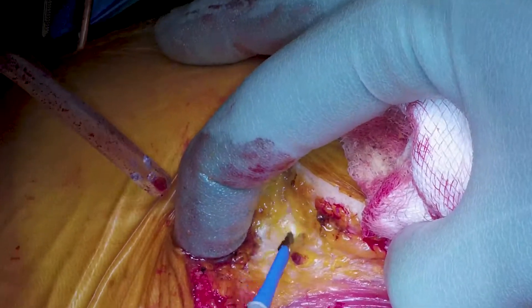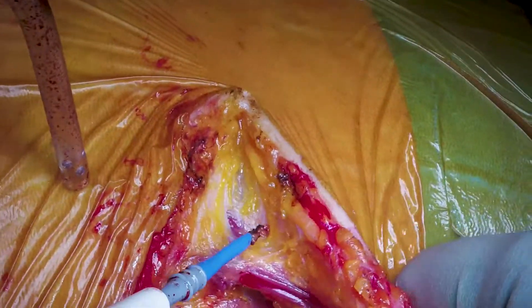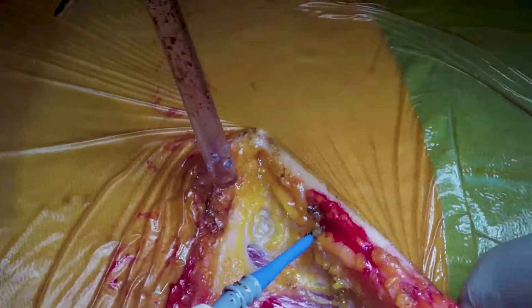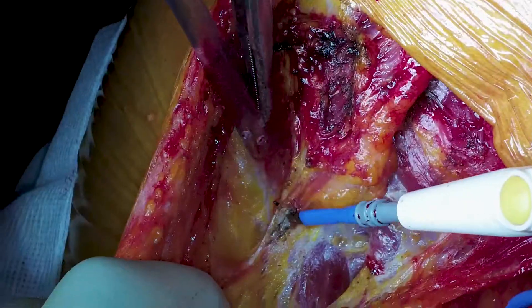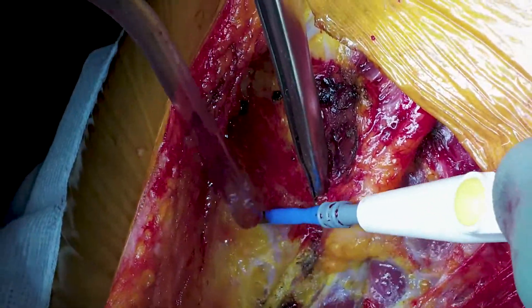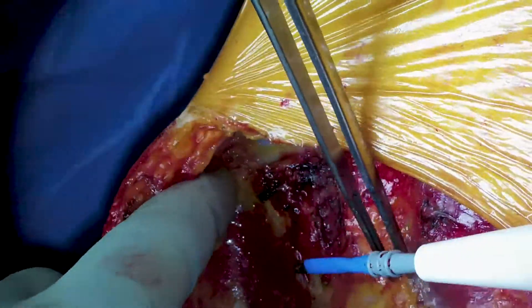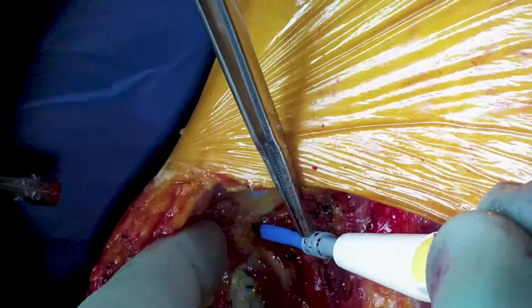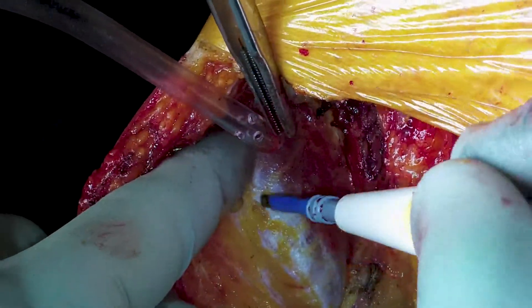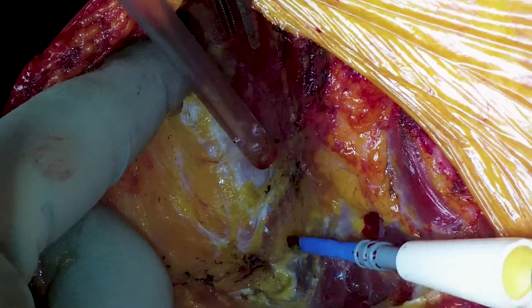In this clip we're using the diathermy to cut through the fatty sheath of the muscle, being careful not to cut it at all. You can then retract the muscle and skin with your fingers, as you can see Mr. Dunning doing on the right, and cauterize any small vessels that bleed through the muscle. We're spending a decent amount of time undermining the muscle here because the more undermining you do early on, the easier it will be to retract later. An important point: there is a risk of getting a seroma of the fat if you do too much undermining, so some surgeons place a drain into this space when closing.